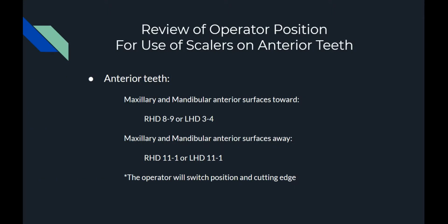Review of operator position for use of scalers on anterior teeth. Anterior teeth. Maxillary and mandibular anterior surfaces toward. The right-hand dominant operator will sit between 8 and 9 o'clock, or the left-hand dominant operator will sit between 3 and 4.